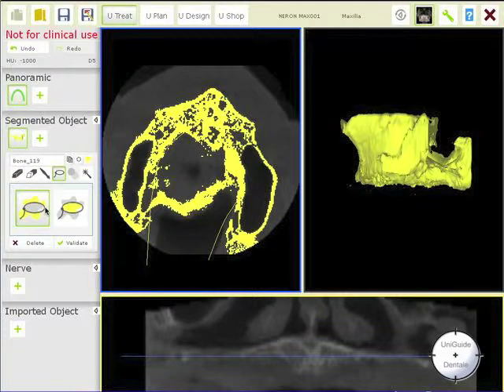It's a full arch and we are going to import an object. We have two options: import a second CT scan or import a digital image of a plaster cast. We are going to choose the first one and we go to full upper double scan.